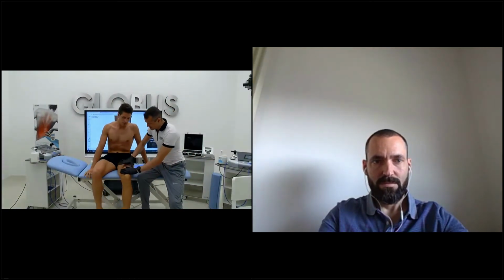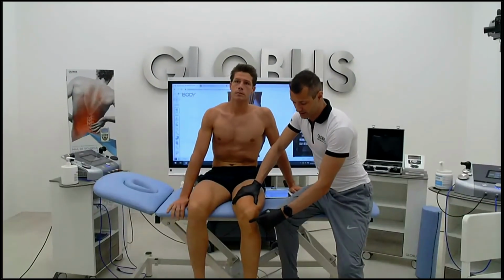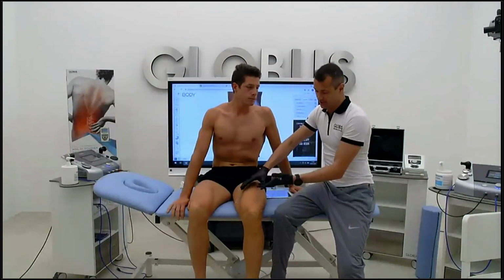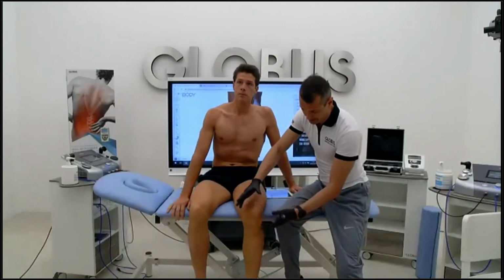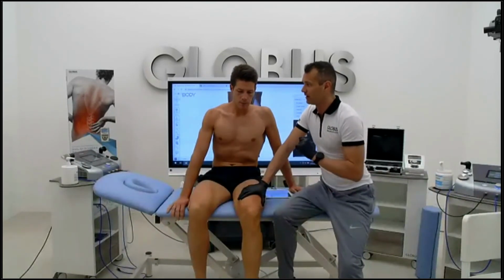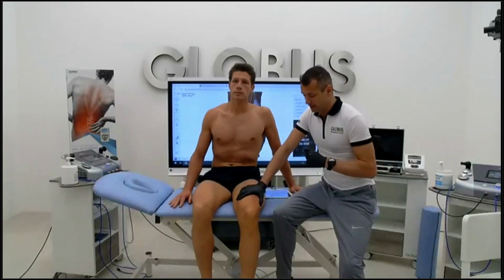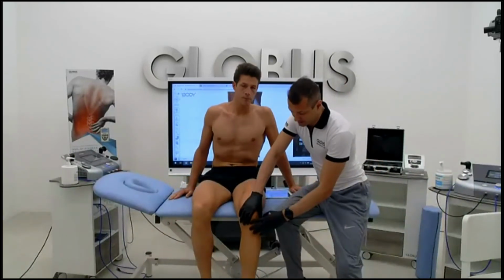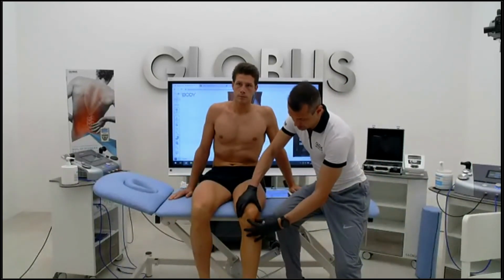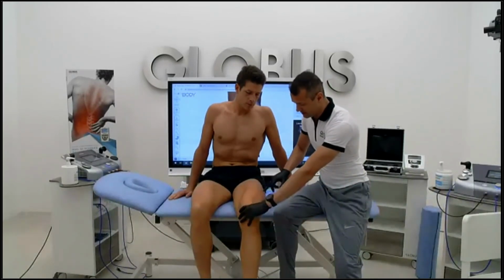Okay, this was the example of acute tendonitis of the patellar tendon. As you have seen, I haven't treated the tendon right now. Maybe we can do it with just a normal resistive way, the small rounded electrode like we did last time. But to help the tendon, I treated the whole quadriceps, in this case the vastus lateralis, at the intersection with the fascia lata.